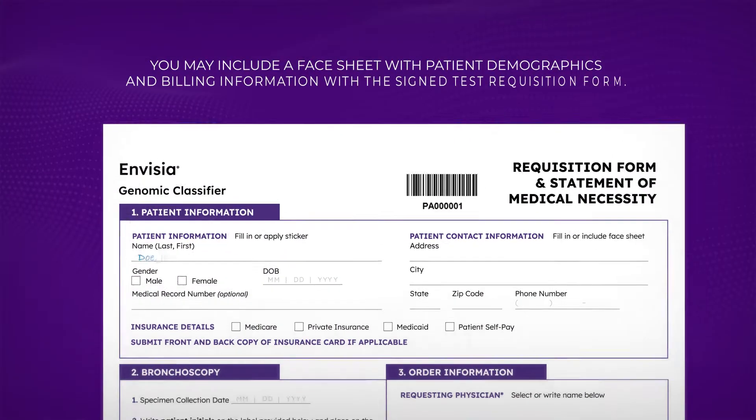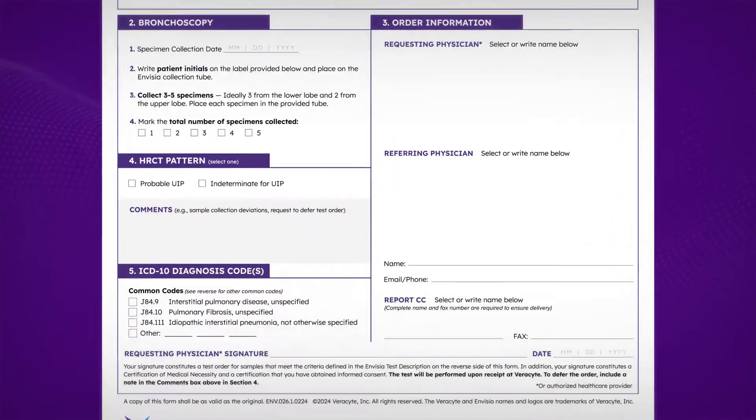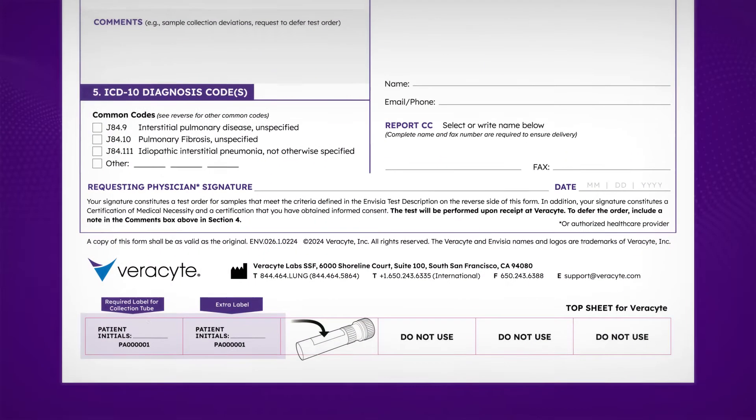Complete the patient information section of the test requisition form and write the patient initials on the labels.